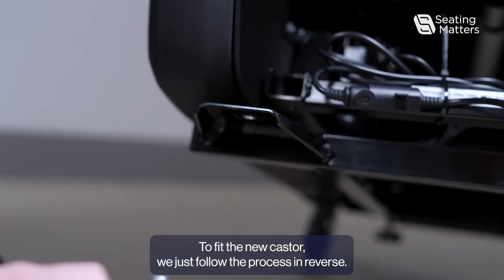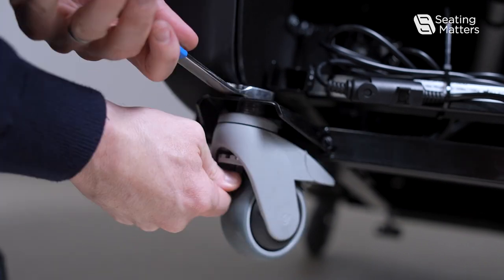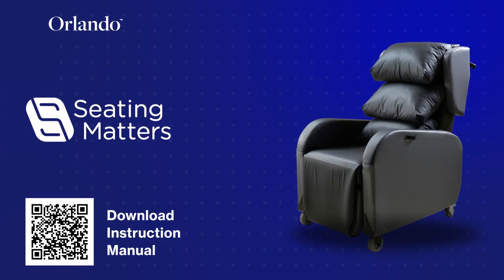To fit the new caster, we just follow the process in reverse, inserting the new caster and securing the caster plate back in place.